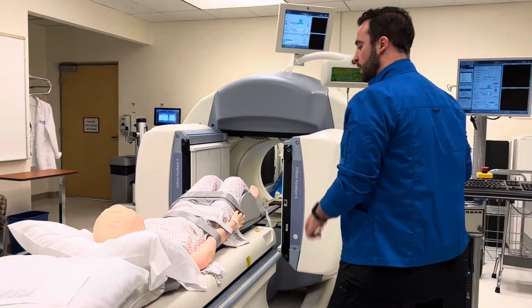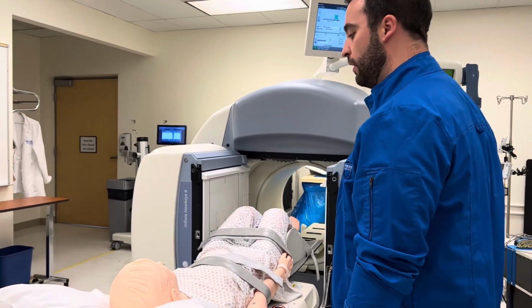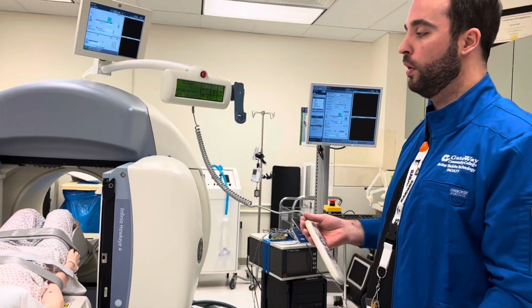Okay, Rosie, the camera's going to come nice and close to your head, and the static will take about 5 minutes, and then we'll move into the whole body acquisition from head to toe. So make sure you talk to your patient as they're going into the camera, what they're going to experience.